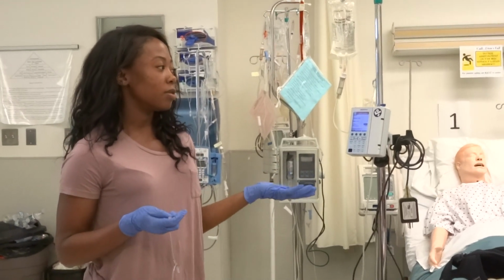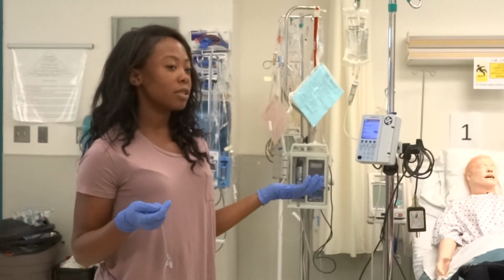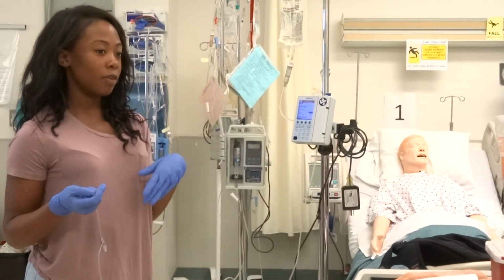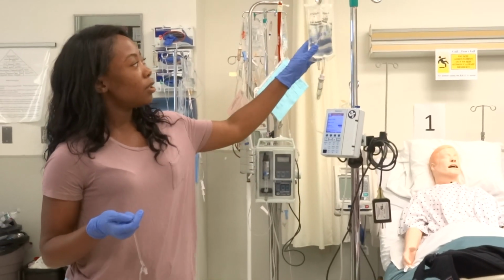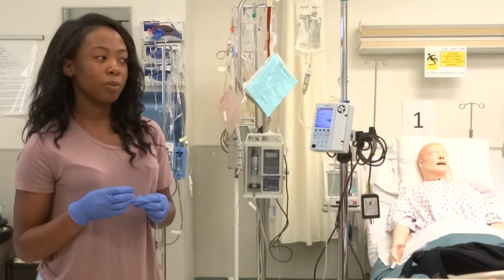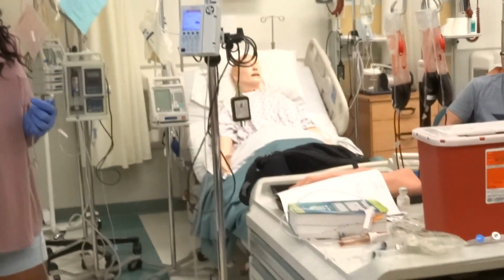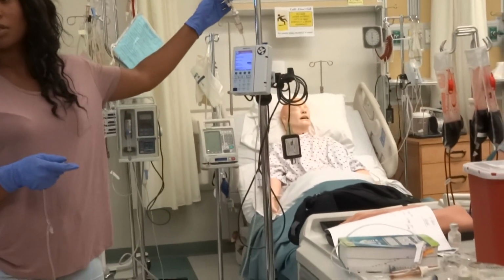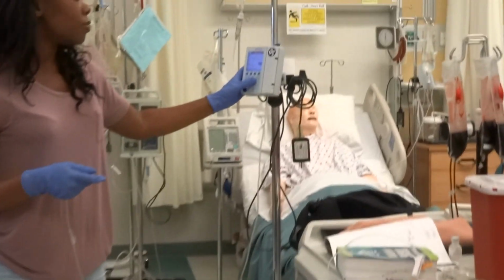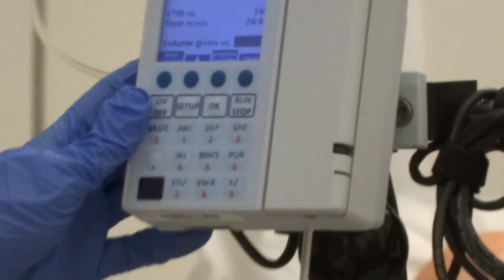And you can let them know this is like a nursing call. It's for my convenience. I'm just gonna set this at a rate of like 260 or 270, because the only thing you're not changing is a prescribed rate, right? Do you guys, am I moving too fast for you guys? A prescribed rate you don't change because the doctor wanted it to go that fast. For this, you can kind of just gauge it yourself. I'd say the volume to be infused, I'm gonna go ahead and say 260. That's just 268, that's fine too.